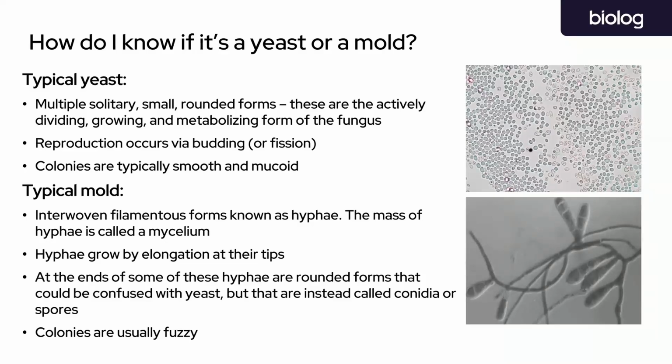Okay, yeah. But as long as it grows on the right agar, like if a yeast is able to grow on that 2% malt extract, then you could get a phenotypic characterization of it. Is that right? Yes, absolutely. So I guess the answer is it is possible, and then just to get the ID, you'd want to just check and make sure that you're in the right database.